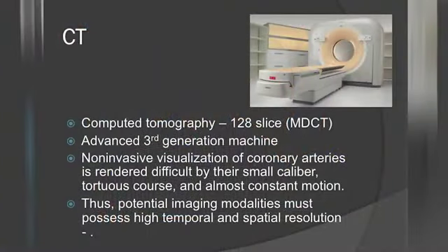Coming next to CT. So we're talking about CCTA, right? So coronary was the first component. CT. CT stands for computed tomography. It is now obviously a mainstay of imaging. Almost all departments tend to have CT. We are fortunate in our department to have one of fairly advanced machines. It's a 128 slice multi-detector CT. 128 is a number which refers to the number of sections it can take within one rotation, okay? And that is a big number.